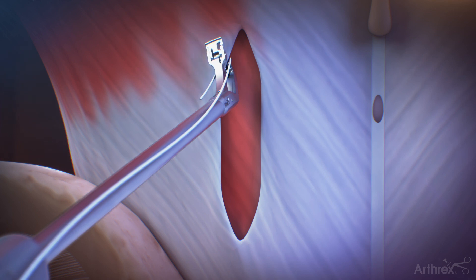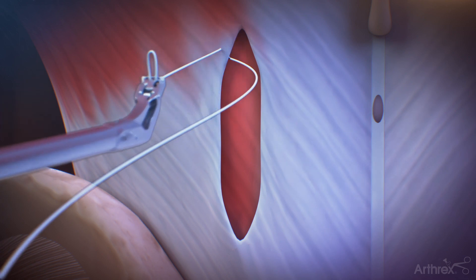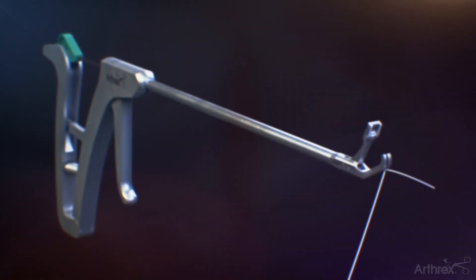Gently close the jaw to grasp the fascia, manipulating as needed. Squeeze the handle to advance the needle, passing the suture through the fascia. Once complete, release the trigger and handle. The jaw will automatically capture the suture and the instrument can be removed from the incision.